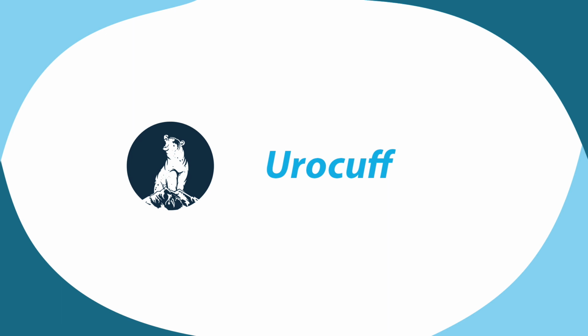Okay, so today is the first time we were doing the Urocuff test in Alaska. This test is designed to tell us the difference if there's an obstruction in the prostate versus the bladder is weak. Patients that have a slow flow can either have a weak bladder or a strong bladder but with an obstructing prostate. You're using the Urocuff to interrupt the flow of the patient. At the point of interruption, this is equal to bladder pressure. So the amount of pressure required to stop the patient's flow is equal to bladder pressure.